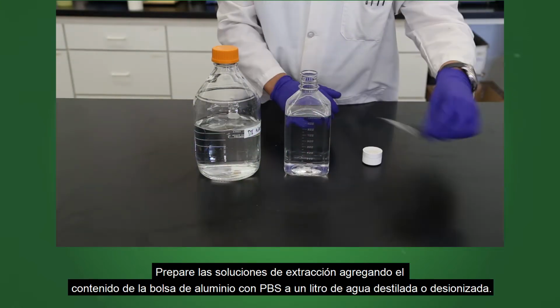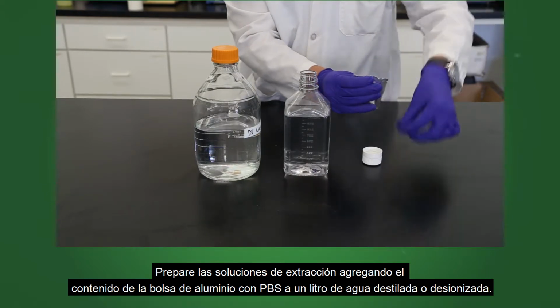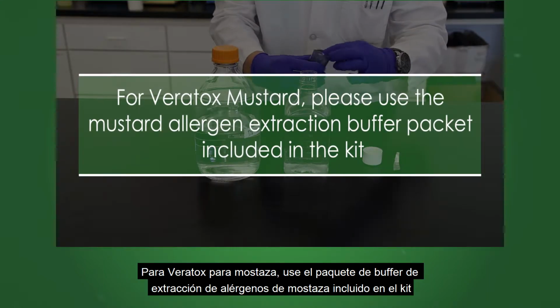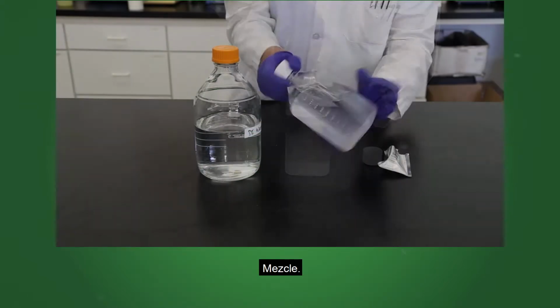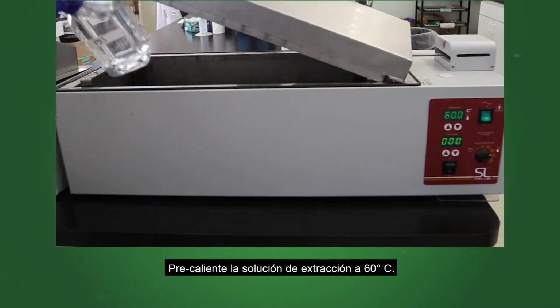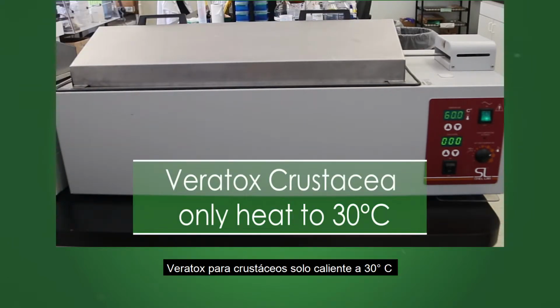Prepare extraction solutions by adding the contents of the PBS foil pouch to 1 liter of distilled or deionized water. Mix. Preheat the extraction solution to 60 degrees Celsius.